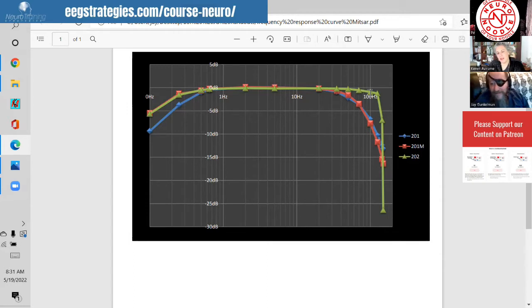But Jay, it's not always just about the amplifier, it's also about the software. Yes. And yes. And I tried a couple of software, and even though the amplifier is really good, and the database also, for example, the neurofeedback software that they provide with it is, let's say, very limited in what you can set up in terms of training. And for me and from my experience, it's really important also.